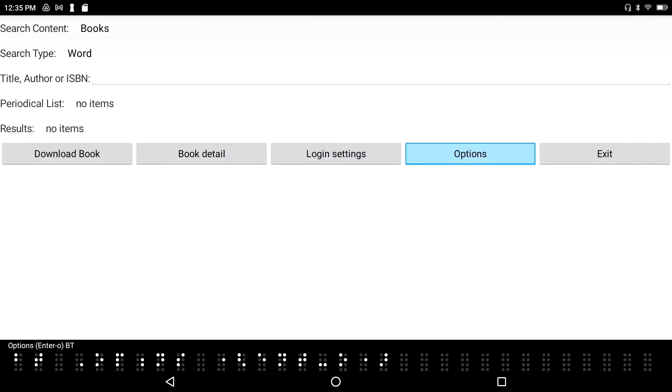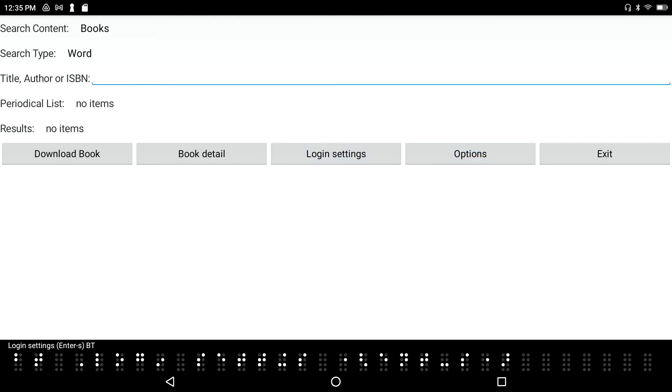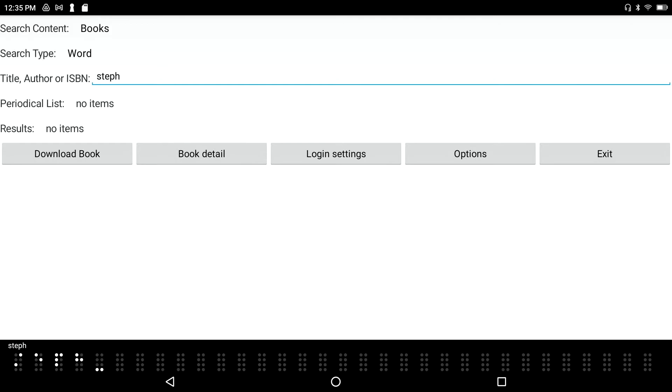I'm going to space tab through this dialogue. Title, author, ISBN edit box. I'm going to type in a title - let's say Stephen King. I'm in contracted braille, so I'll press S-T-E-P-H-E-N. That's the Stephen with the P-H-E-N, and K-I-N-G. Press enter.